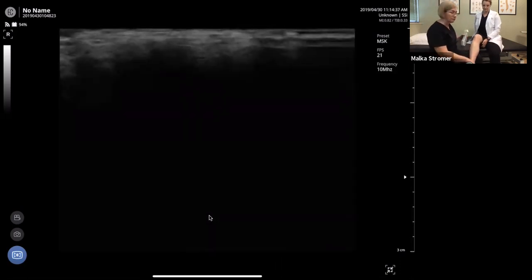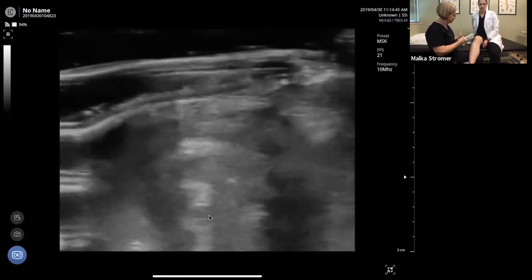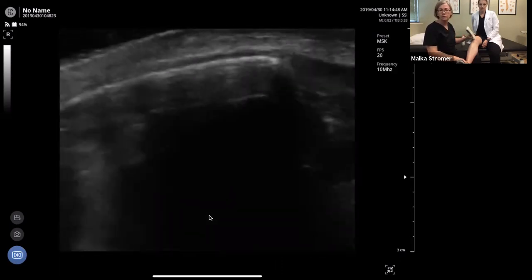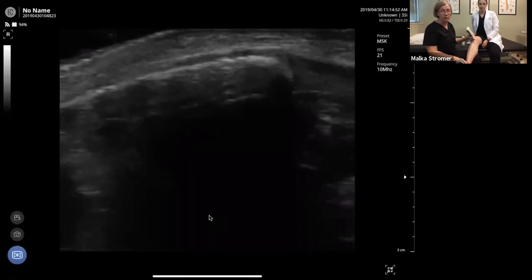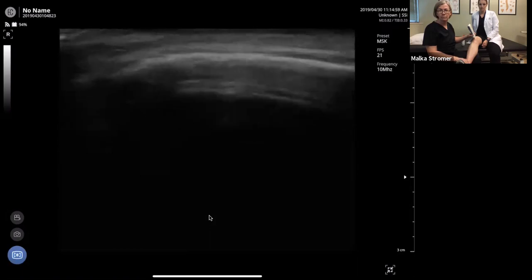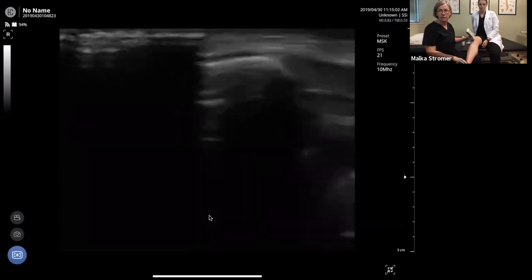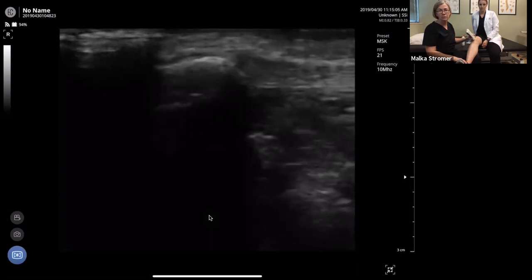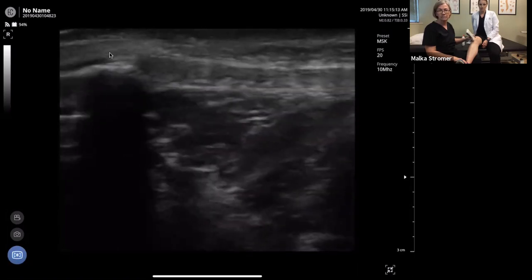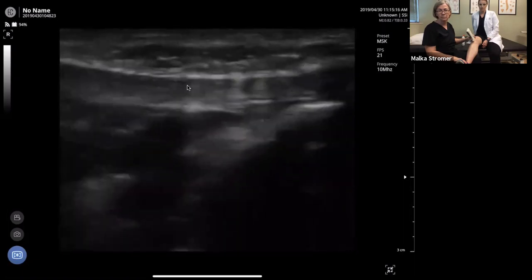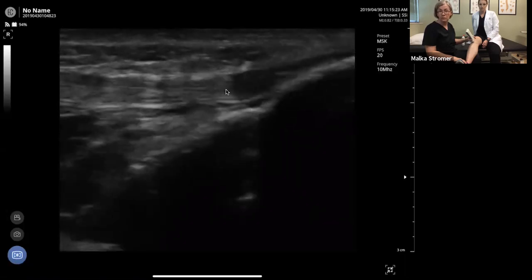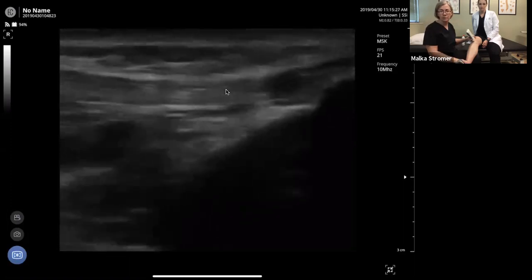We're going to flex her knee a little bit and go to the patella tendon, starting directly on the patella. One thing with musculoskeletal is to always give yourself a bony landmark — putting the probe in the middle of something doesn't tell you where you are. Start with a bone and let that direct you; if you get lost, go back to the last thing you knew. We have the patella at the left of the screen, and the patella tendon running straight down to the tibial tuberosity — nice looking tendon.